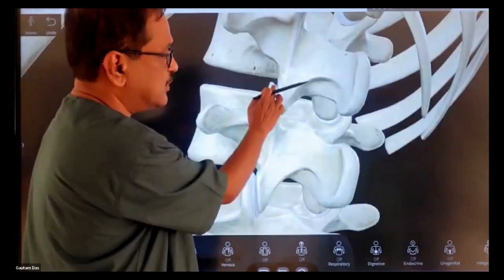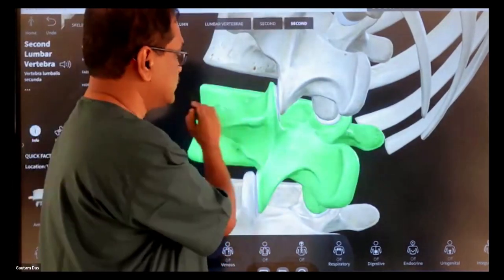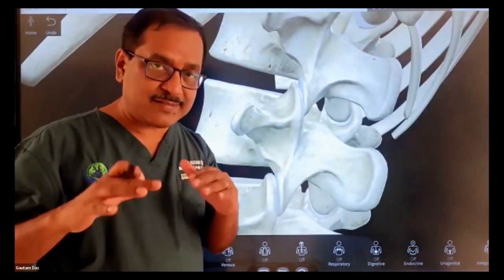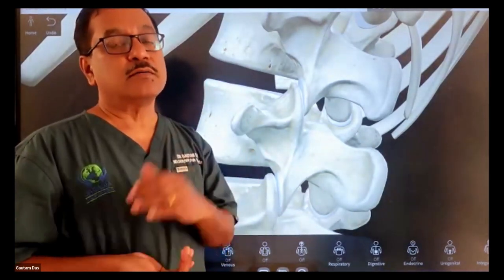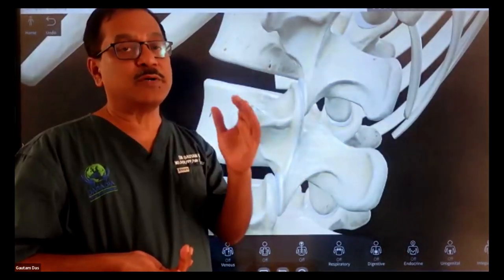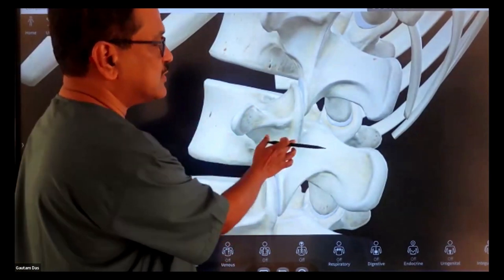For the intra-articular approach, normally in the lower part of the facet joint we try to go for the injection. But as I told you, intra-articular facet joint injection is inferior to the medial branch block. Medial branch block nowadays has long-term results and more evidence compared to intra-articular facet joint injection. So these are the 2 procedures we'll be demonstrating. Remember how to orient the C-arm.